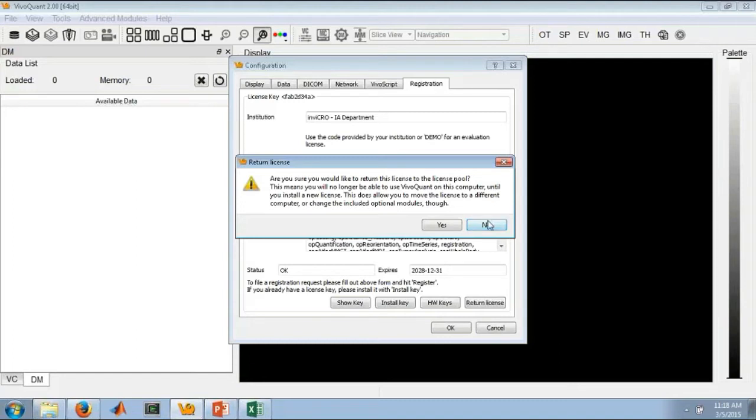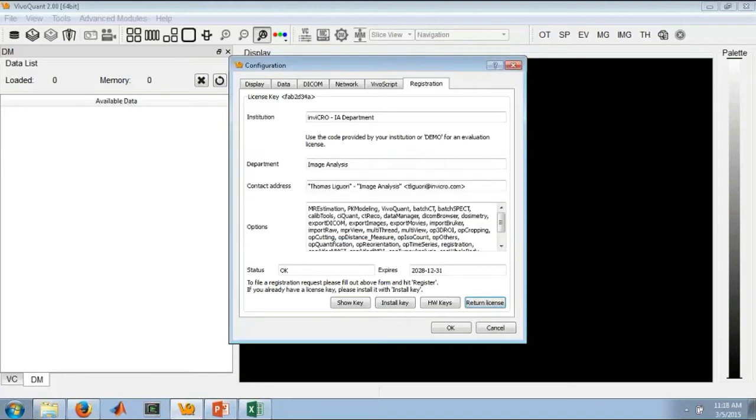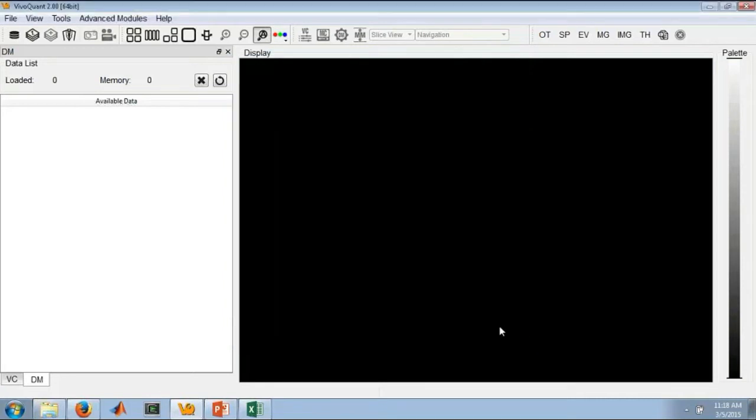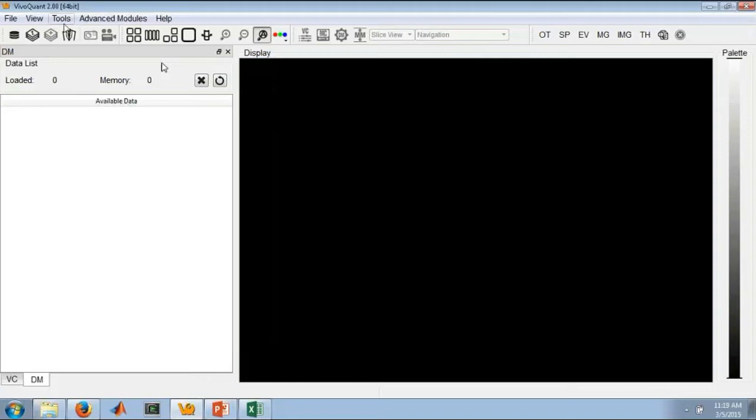Here I'm obviously going to say no. I do not want to return my license right now. That would make for a very short demo. So once you're registered and your license has been installed, now you're ready to use the software. As I said, the buttons are all new and different, but a lot of it has really stayed the same in terms of functionality.